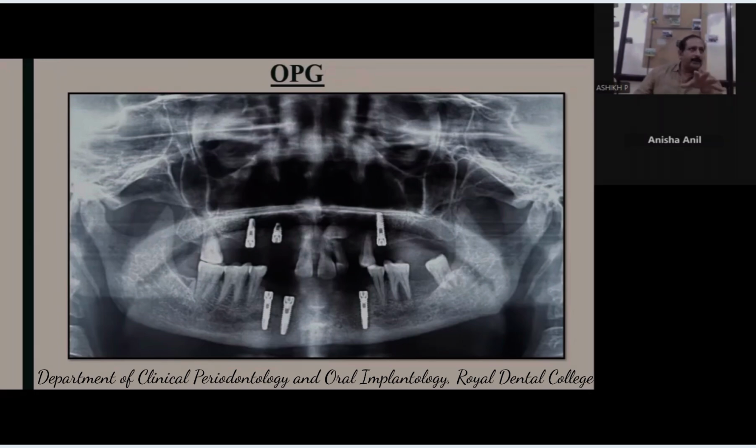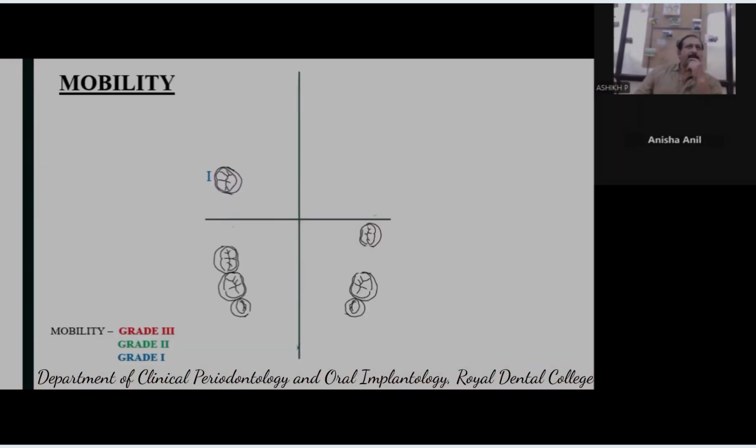So first let's calculate the height of the available bone, because you're comfortable with the position of the implant, which will definitely be with the outer diameter of the implant 3 millimeters away from the nearby tooth on one side, and on the other side sparing 2 millimeters of bone in the socket region. Let's see the height. Height of the available bone.